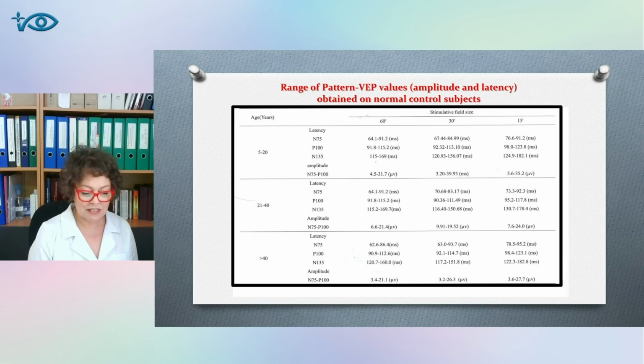The significant difference in VEP components of two eyes during the monocular recording is an evidence of the prechiasmatic visual pathways dysfunction that may occur due to the pathology of the optical media, retina or optic nerve. For more accurate localization of chiasmal and postchiasmal visual analyzer lesions in both hemispheres, the topographic mapping method is used, when the recording is made from two hemispheres in the presence of 6 channels with active electrodes and a common reference electrode. In the near future, we will apply the multifocal VEP program, which allows for more accurate localization of the posterior lesion in relation to two hemispheres, subcortical nuclei and the cerebral cortex.